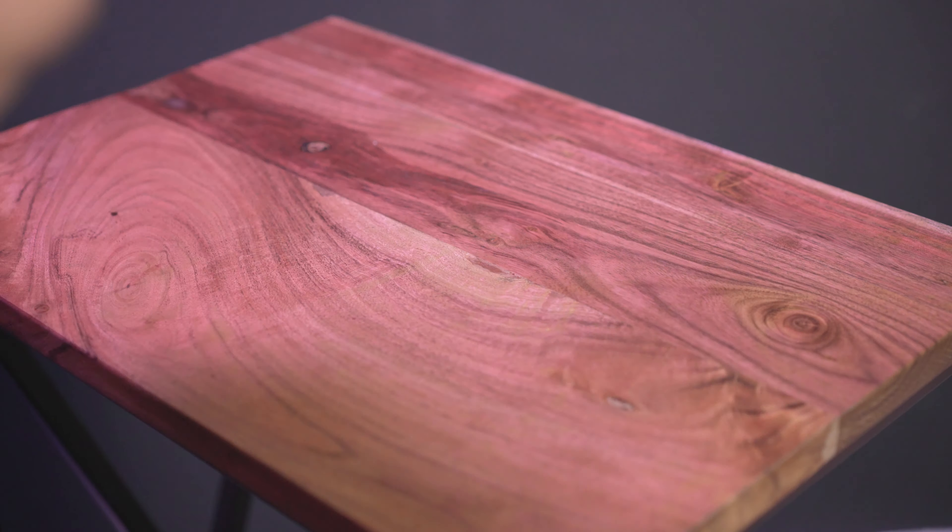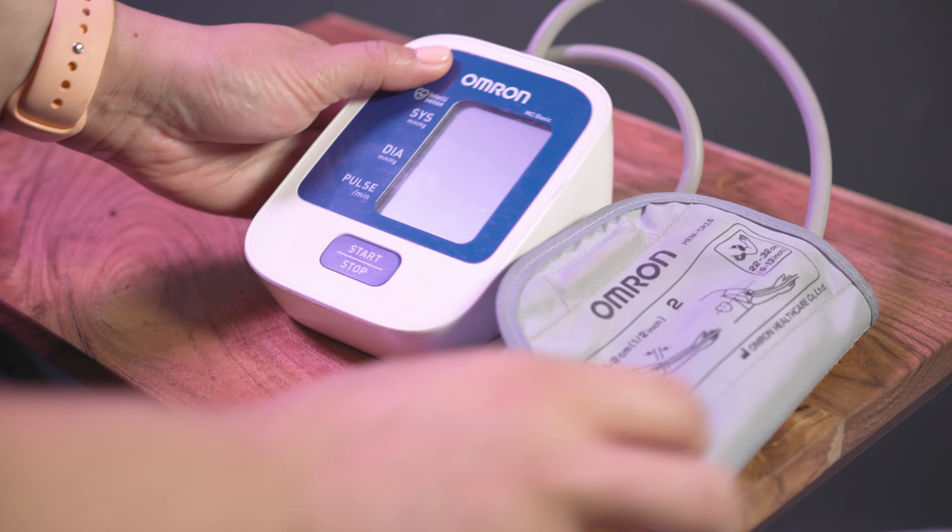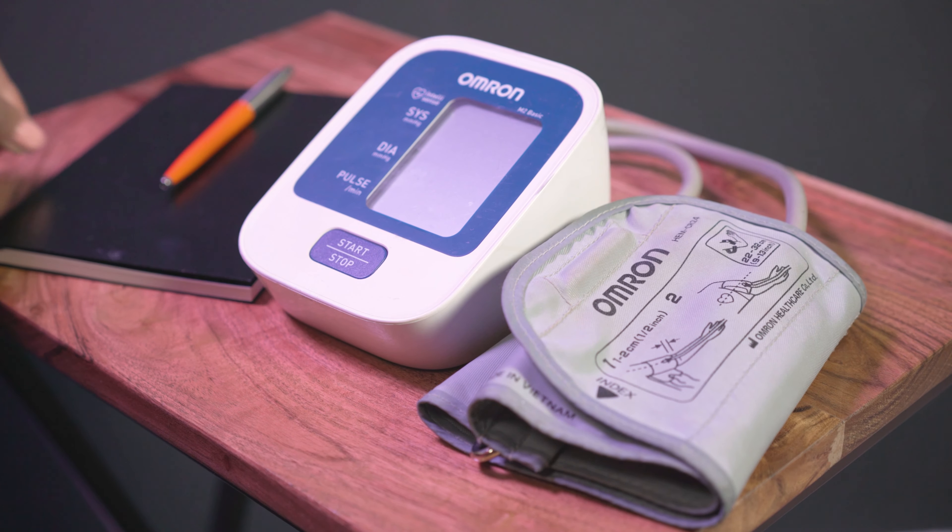What equipment will I need? You will need a blood pressure monitor, pen, and somewhere to write down your results. Monitors can be obtained cheaply online or from your local pharmacy. Ideally, you should choose one which uses a pressure cuff around your upper arm, a comfortable chair with a supportive back, and somewhere to support your arm.